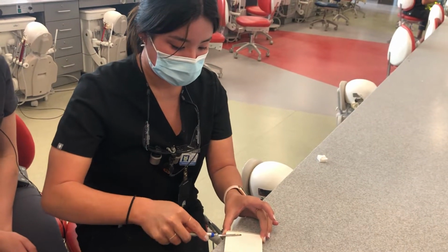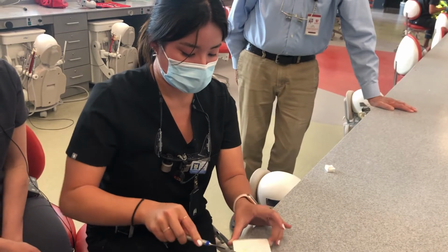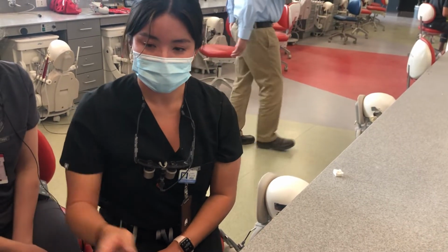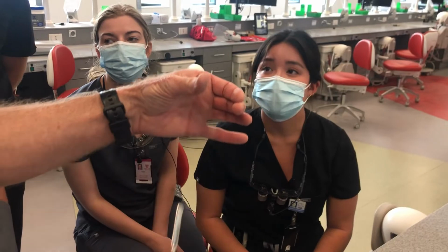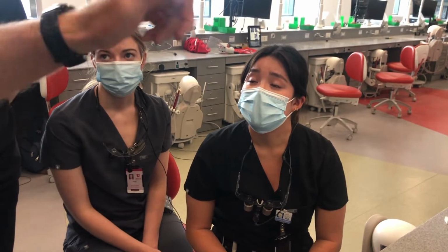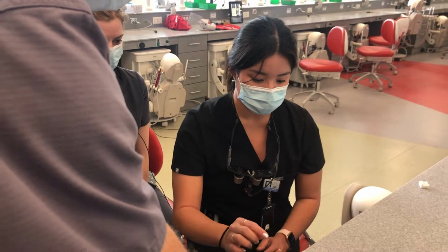Good job. Now gather it all up, just like you're going to insert it into a crown. Turn the crown upside down. You take this just along the side of it, so that the inside, the edge, the margin picks up everything. Spread it to the margins and it's ready to insert, okay? So that's basically it, nicely done.